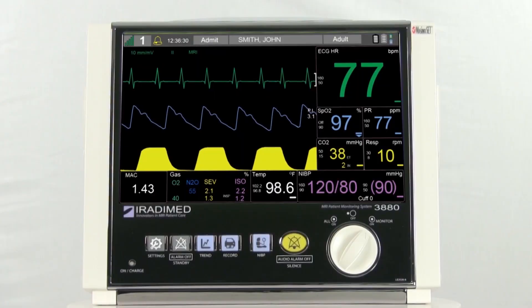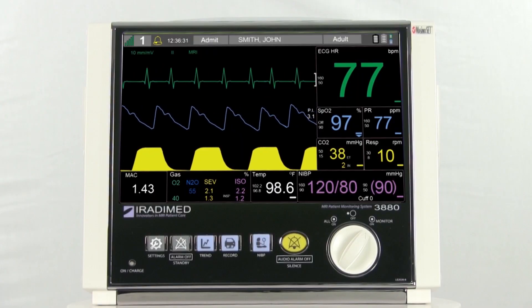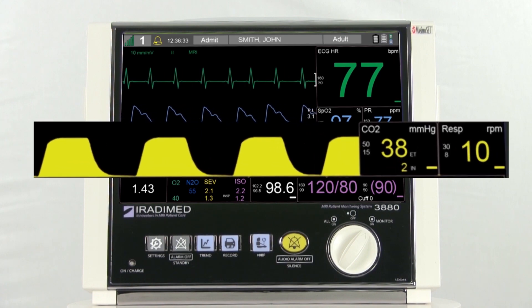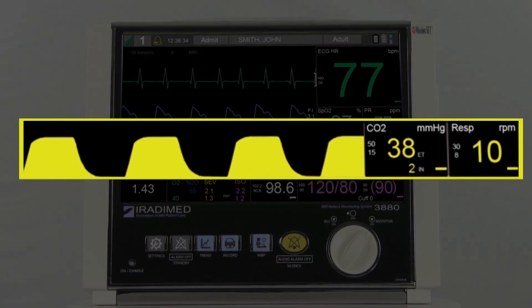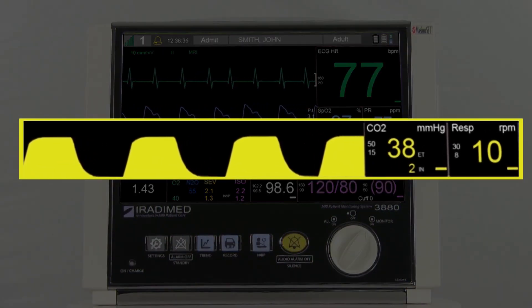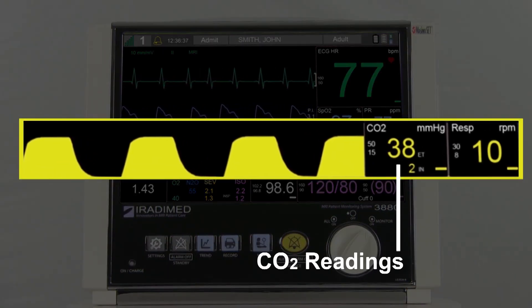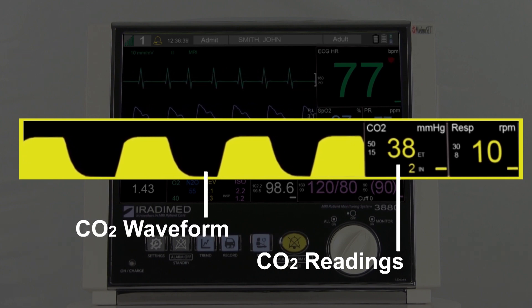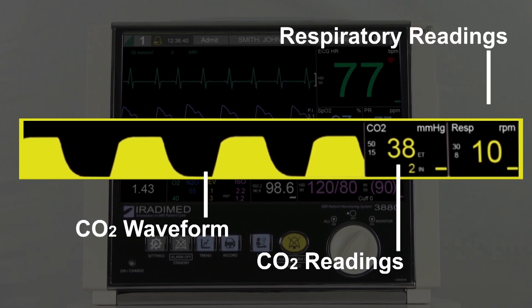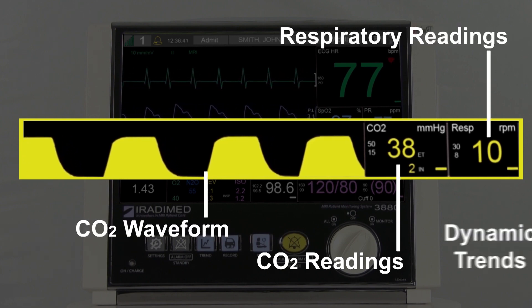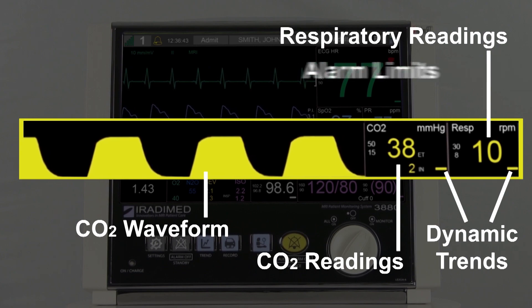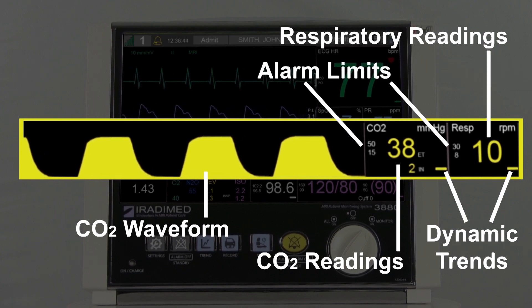The CO2 readings will be displayed in the yellow section of the patient monitor. Here the user will see the CO2 readings, CO2 waveforms, respiratory readings, dynamic trends, and alarm limits.